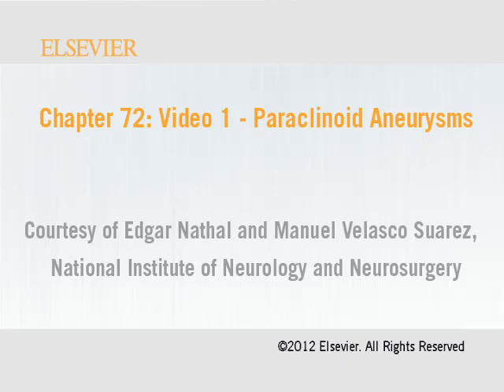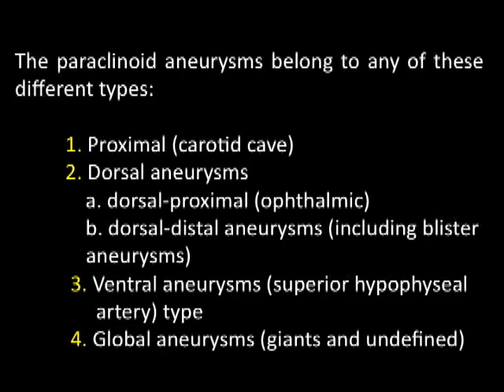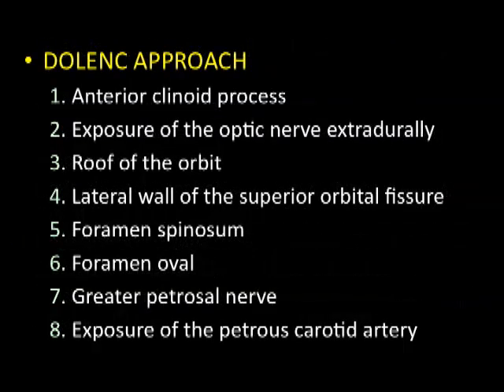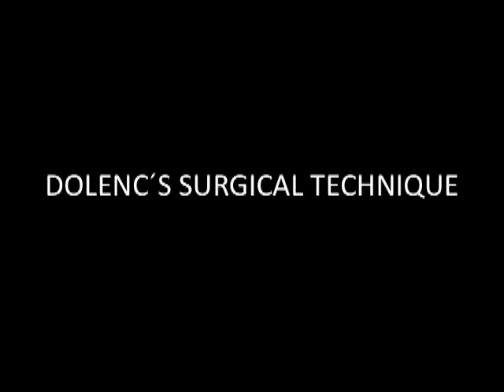In this video, we will show the surgical steps of the Dolenc approach, applied to the treatment of paraclinoid aneurysms. The paraclinoid aneurysms are a group of heterogeneous aneurysms located around the internal carotid artery, the anterior clinoid process, and the optic nerve. The Dolenc approach has 8 steps that should be completed extradurally before attacking the aneurysm.